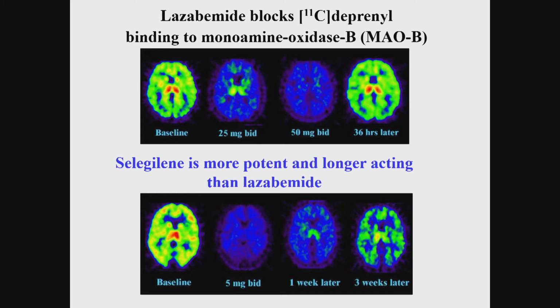So this can be like a $200 million question. And you can use the radiolabeled compound to say, for example, with this compound, I think 25 BID is more than enough. And I think we should give it, you know, maybe even once a day. But it'll give you some rough guidance. And if the 25 milligrams BID does not treat the depression, you can say, well, this drug is ineffective at acting at this target to treat depression. And you really know that it's a negative study.